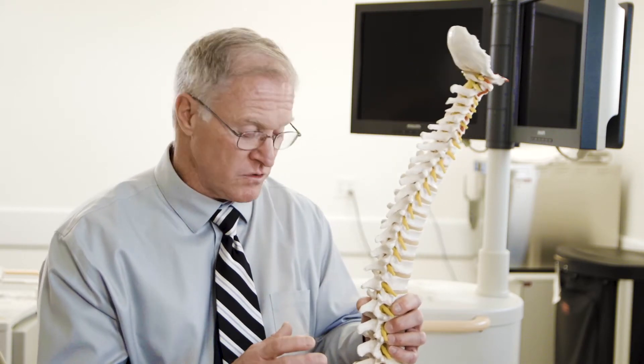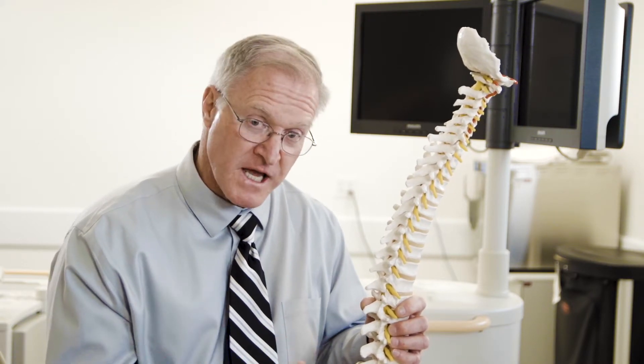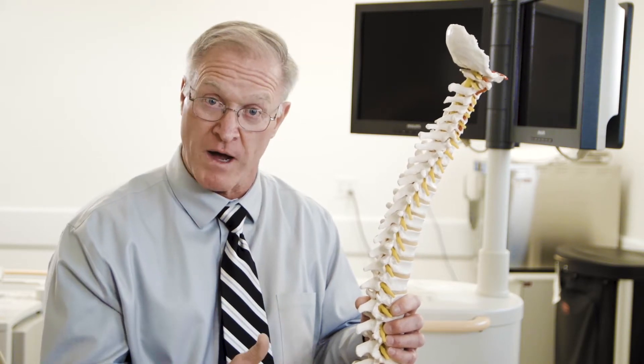We're going to leave the rest of your spine and other potential pain generators in your low back and buttock untreated, because we specifically want to identify whether or not that joint is the primary pain generator. If we are unable to get the contrast to spread into the joint, we'll numb the nerves that go to the joint — so one way or the other, at the time I'm finished with the injection, that joint is numb for the next few hours.